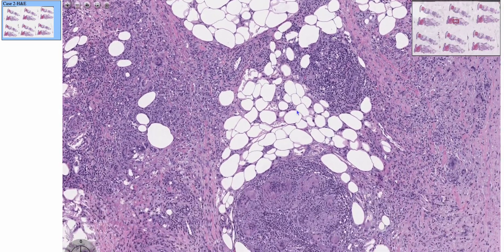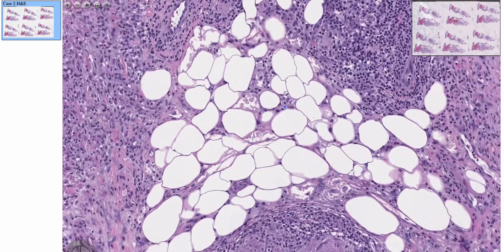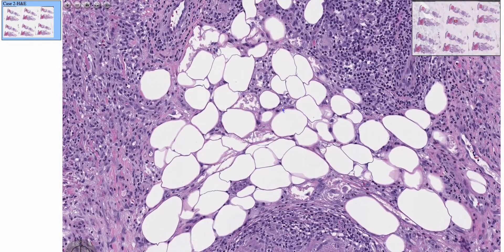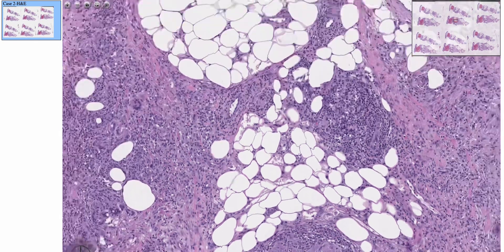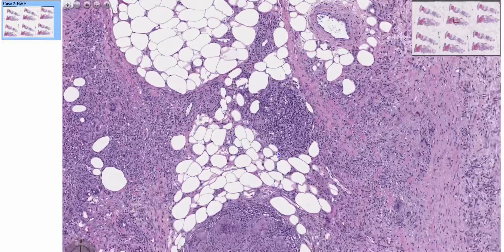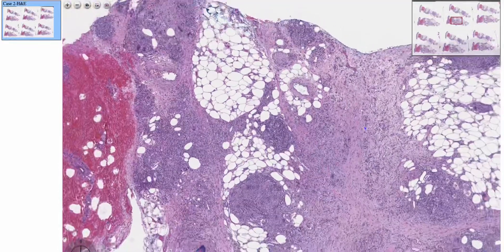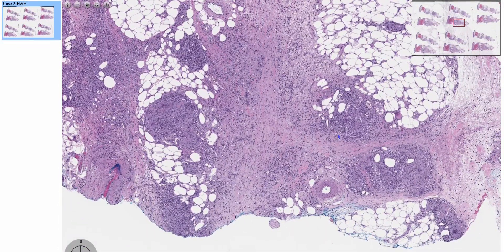We can see here there's some chronic inflammation as well as some fat necrosis. And your characteristic finding for erythema nodosum, if you get asked by staff, are these Miescher radial granulomas.